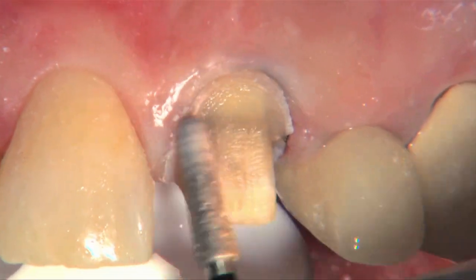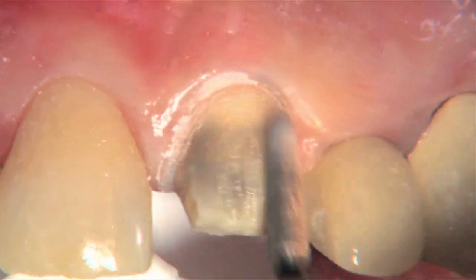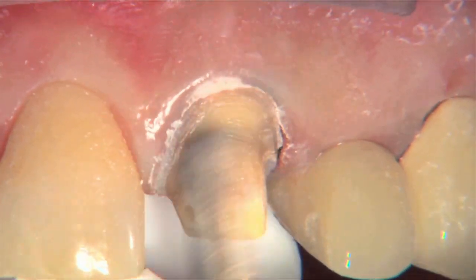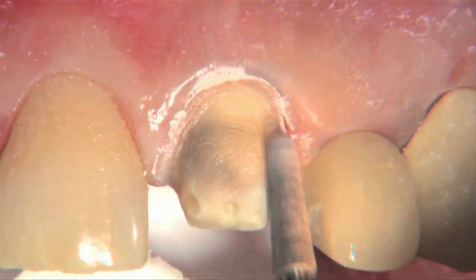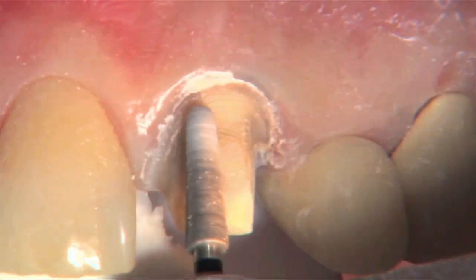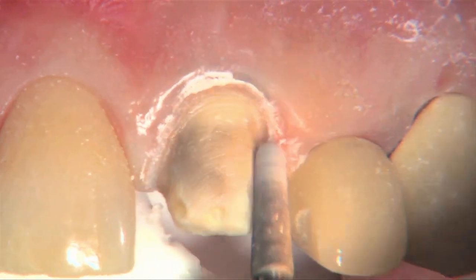Prior to using digital impressions, this is how I finished off the prep. I would take my electric handpiece, turn the speed all the way down from 40,000 RPMs down to 2,000 RPMs and turn the water off because the burr's spinning so slowly. And then with a light touch, use my 856-025 burr to really go in and blend all the planes together and smooth the margin. You can see that with the water off, you can really tell what you're doing because it leaves a nice little line of powder right next to what you're doing. And it's not obscured with water because we're running this burr at such a slow speed and using light pressure strokes so that we're not overheating the tooth. Obviously, this is an endo tooth, but I use this same technique on all vital teeth as well. And so it was really nice to be able to go in and do this.